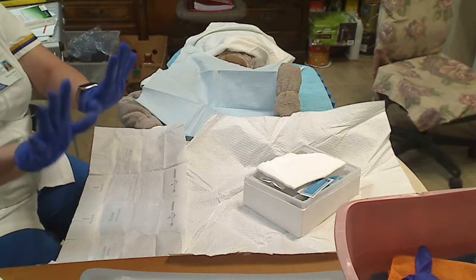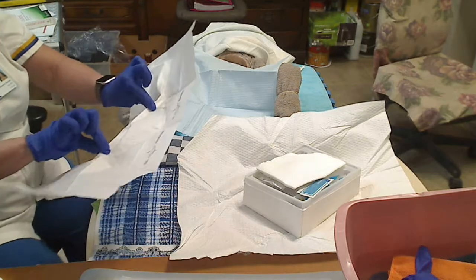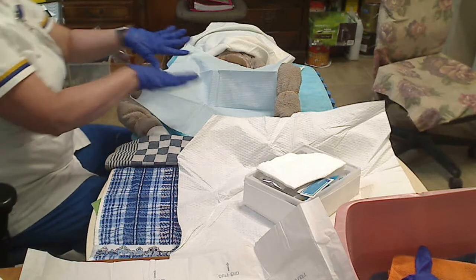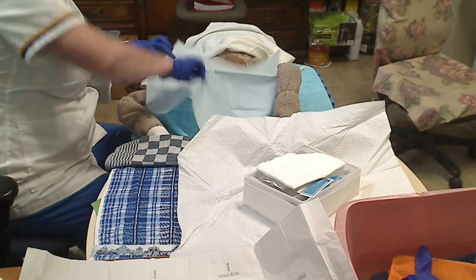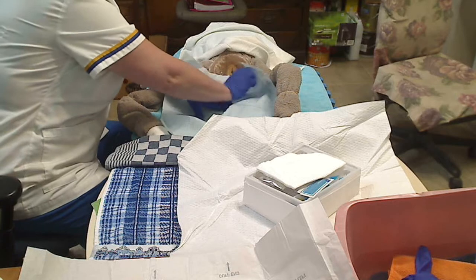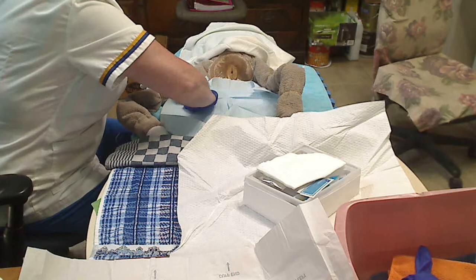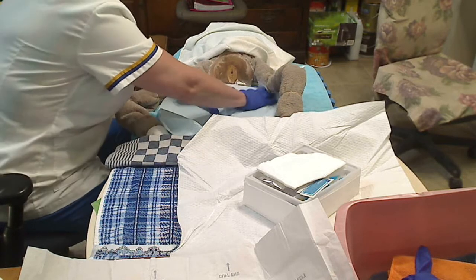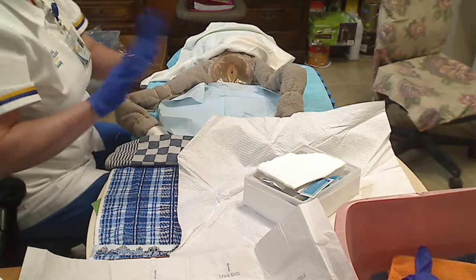Now I am sterile. From here, I'm going to go ahead first and move my paper wrapper for my gloves. I now am allowed to touch this drape because it's sterile. So I'm going to go ahead and touch the top of the drape only and place it underneath her legs. And pull it down slightly so that I'm exposing just her perineum area.